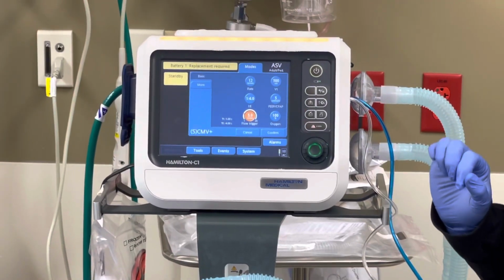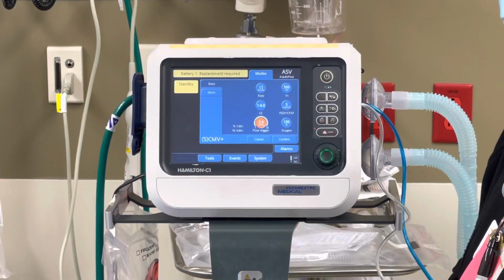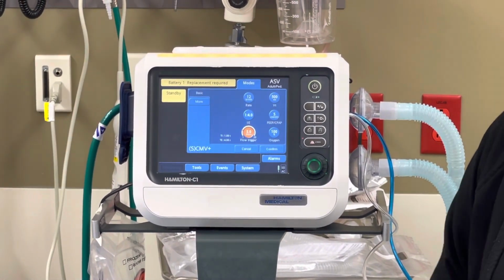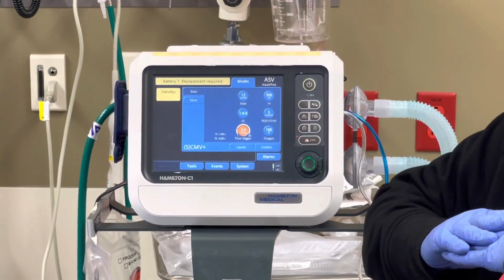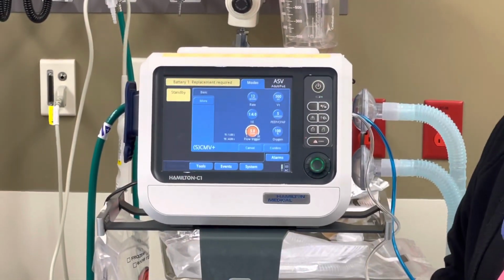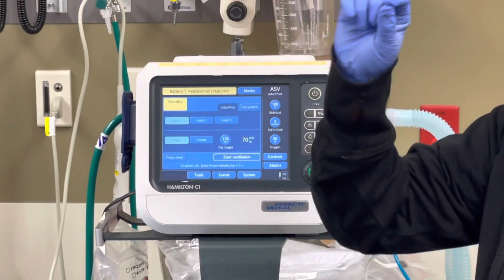In what increments would you dial that up? So it really kind of depends on how they're oxygenating. You have to look at the SAT and kind of look at your patient. And if you're running an ABG, that's a really good way to know, because once you get that PaO2, you're gonna know, because sometimes my PaO2 will be really low. In that case, I would probably jump from 5 to 10. But in most cases, I'm probably gonna go from 5 to 8, 8 to 10, 10 to 12, 12 to 15. That's usually what I do. I kind of just step it up.